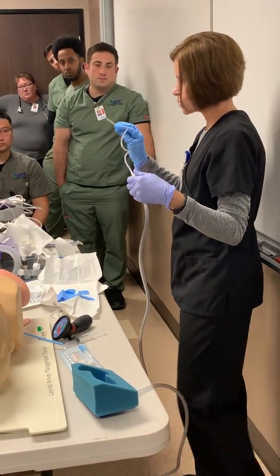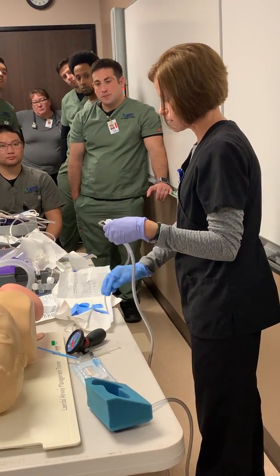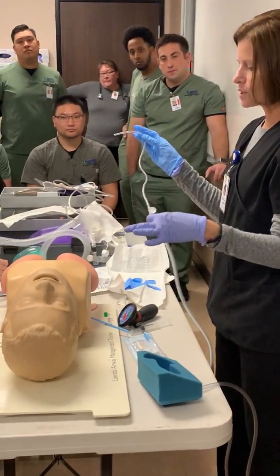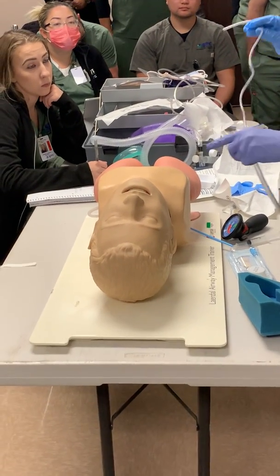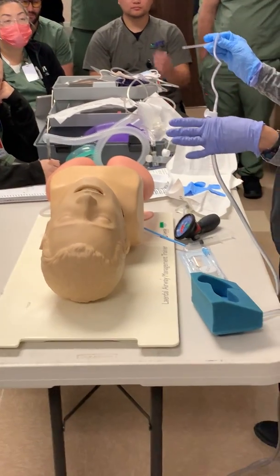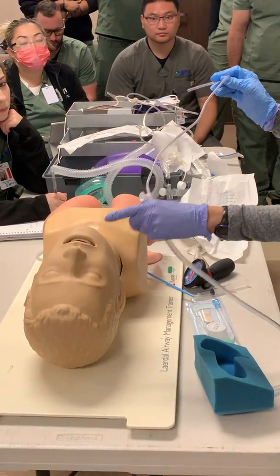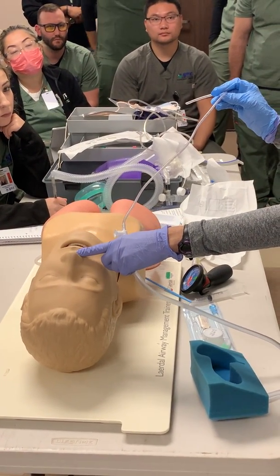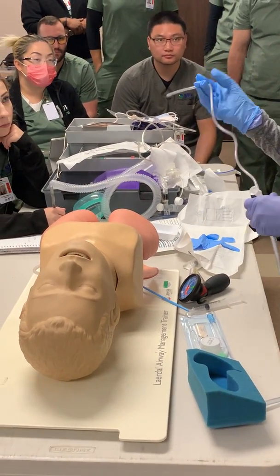Okay? This is where now I'm gonna keep just a couple inches out. I'm gonna dip it in the jelly, KY jelly or whatever your lubricant is. And I'm gonna go to the patient and I'm gonna see which nare that I think I can get through. Sometimes people will occlude one side and say, try to sniff in, or ask the patient, do you have a deviated septum, or have you ever had your nose broken? Or a nurse will already have an NG in one of the nares. If the patient has an NG, that nasogastric tube, you can't put the catheter down there.